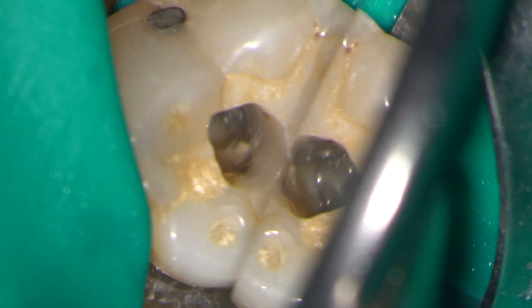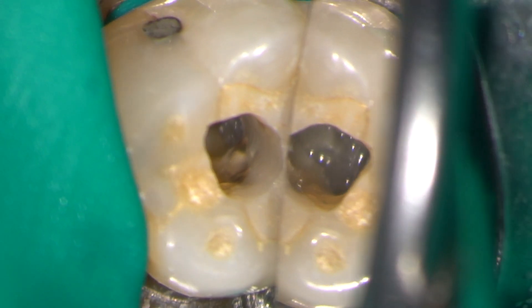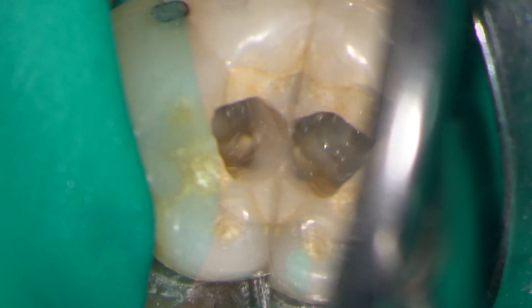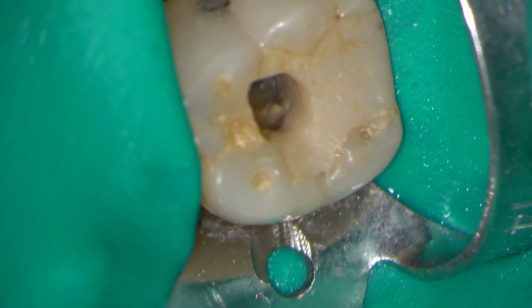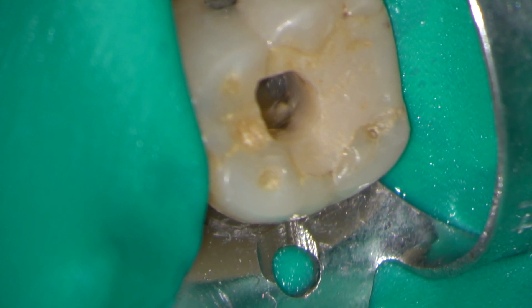The pulp floor is still covered in calcific material, and so I'm going to use the ultrasonic tip again just to clear this away.